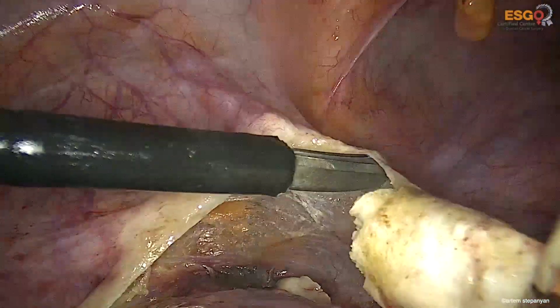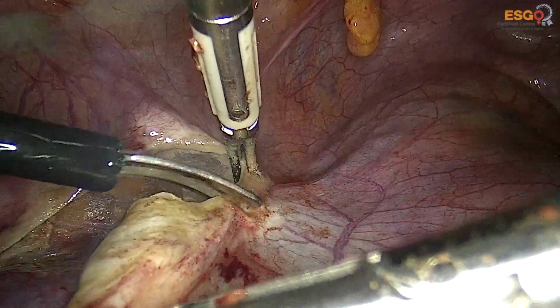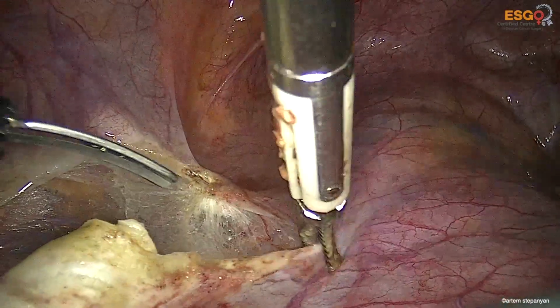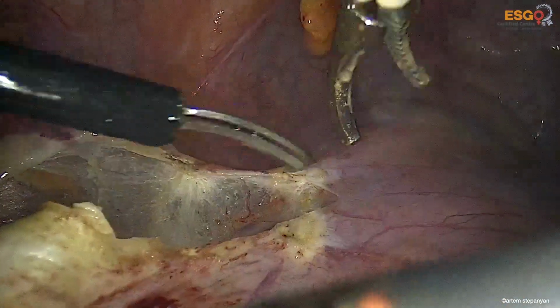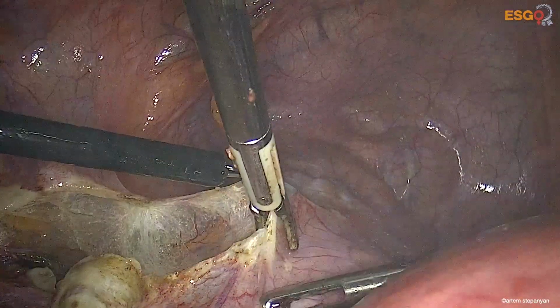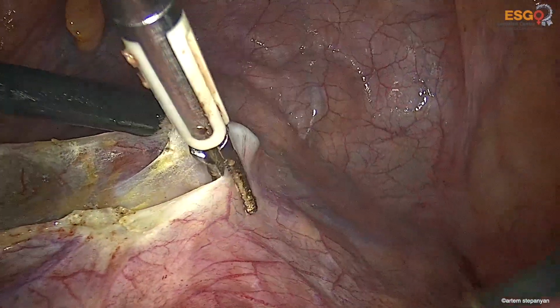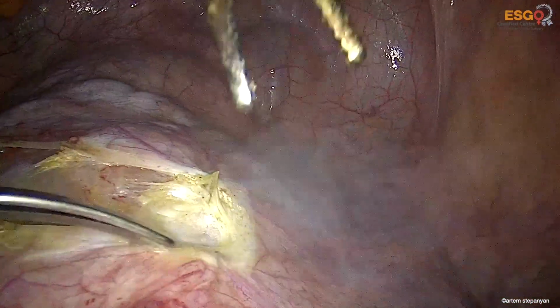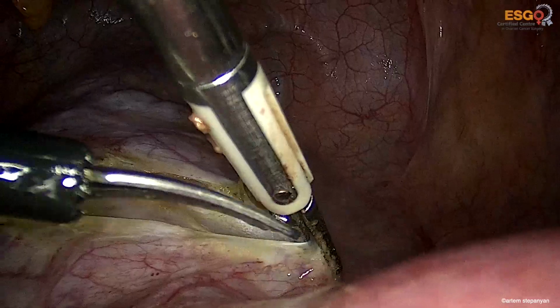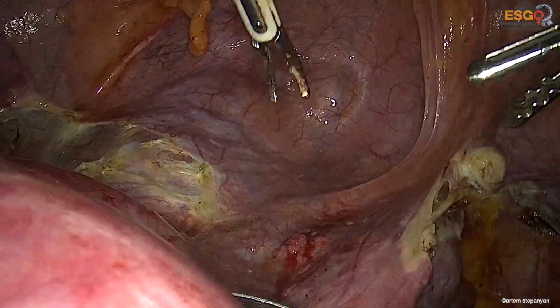And again, we cut the left round ligament and advance the incision of the anterior leaf of the broad ligament of the uterus towards the vesicovaginal fold, and then towards the contralateral round ligament.